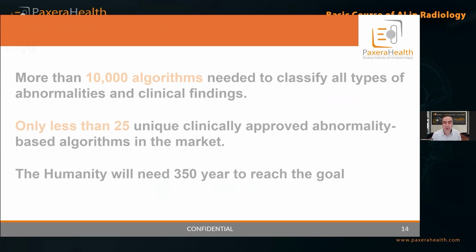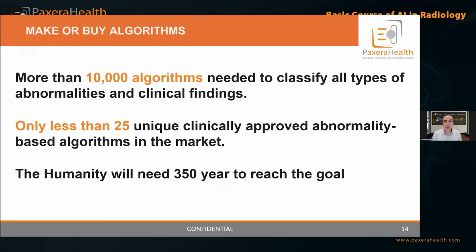There's also the fact that we have seen a few commercial algorithms existing in the market, and some applications, but how many applications have been developed? We see that there are no more than 25, maybe 50 clinical applications in the market. Maybe 80% of the commercial algorithms are focusing on chest X-ray, brain hemorrhage, mammography, microcalcification and density, bone fracture, and maybe a few other applications.